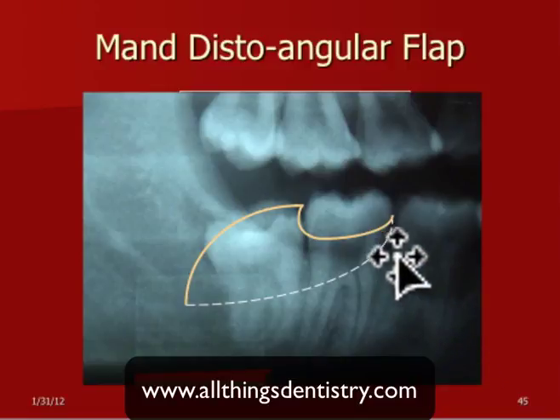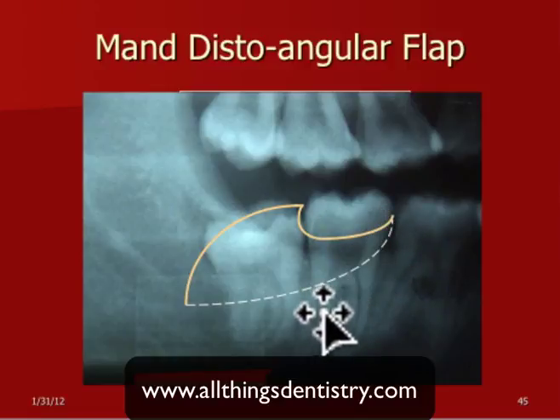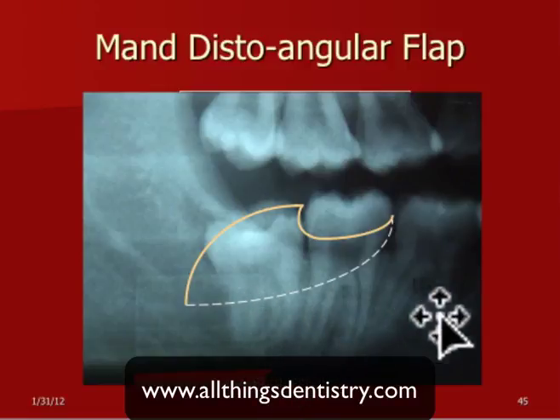And when you have long roots like this, if it doesn't come out real quickly, I'd go ahead and section the tooth, because if it breaks, it's not going to break up here. It's going to break about halfway down the root socket, somewhere in that peninsula. So big difference between an island of interseptal bone and a well-connected peninsula. So that's something to consider when you're taking those out.